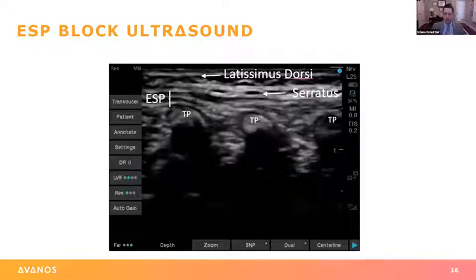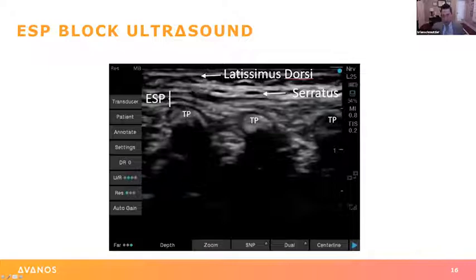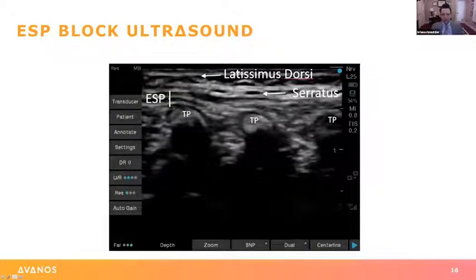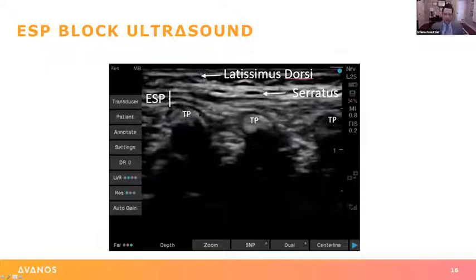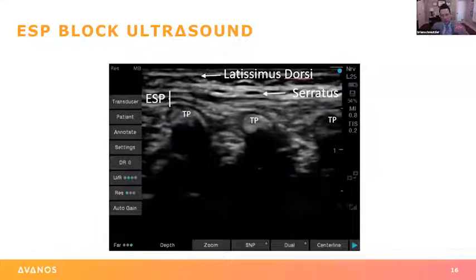Looking at ultrasound anatomy — this is a pretty thin patient, so we're only about half an inch down from the skin. We're in the low thoracic, high lumbar spine. You can see the lat dorsi, the serratus, and the erector spinae muscles. The erector spinae plane sits right over the top of those transverse processes. Our goal is to hit the transverse process with the needle, back off ever so slightly to come off the bone, inject, and confirm that the local anesthetic goes underneath the erector spinae plane — anterior fascia of the erector spinae muscle and posterior to the transverse process.